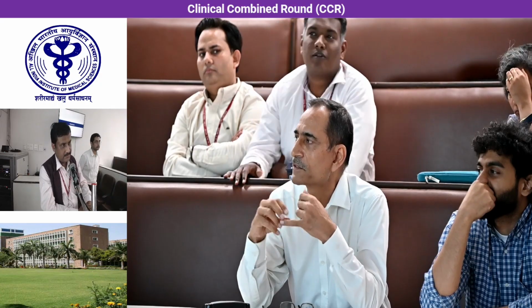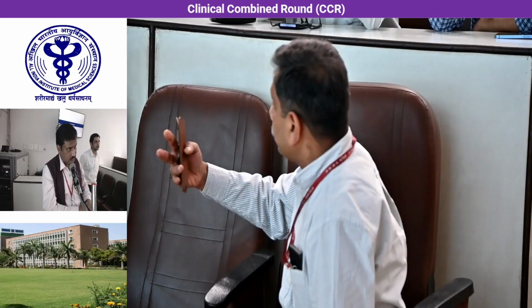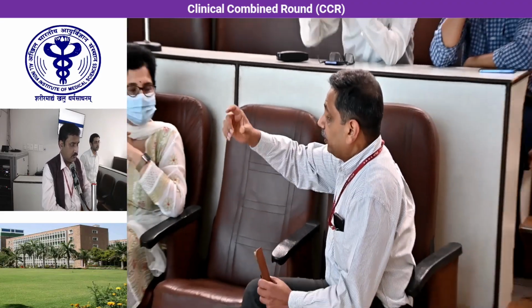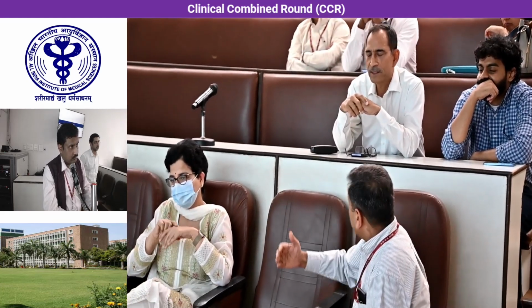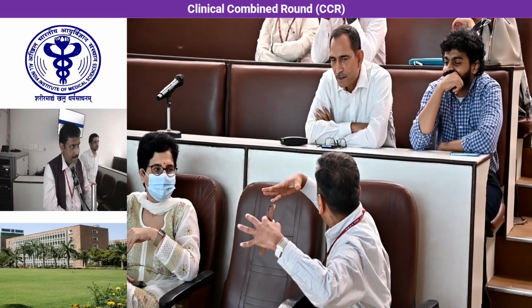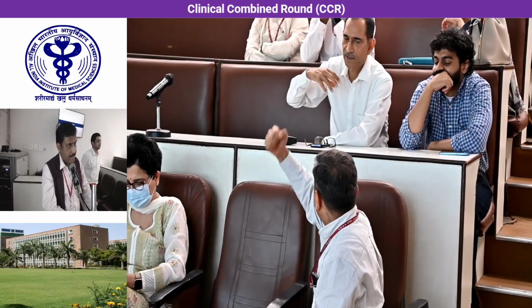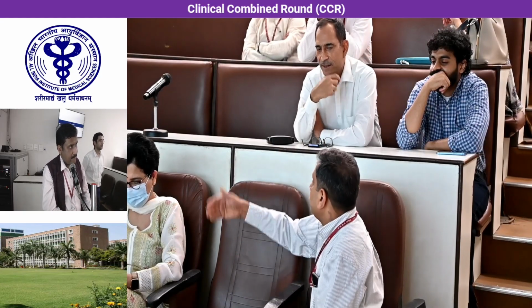Yes, yes, yes. Once you have a filter, operating becomes difficult. You can't put a clamp where the filter is. So the filter occupies 3 to 4 centimeters of the length of the cava. You lose that now, and you have to go higher. And removing that filter sometimes is very difficult. Yes, claws go into the wall on the side. So you pull it from above. So theoretically, there's going to be a delay to put this.